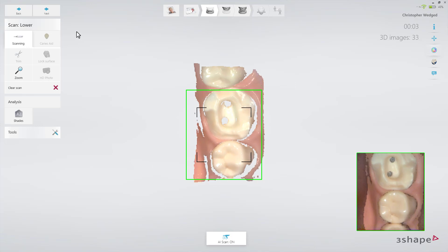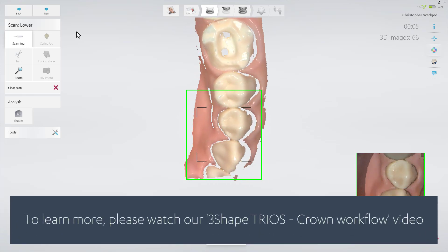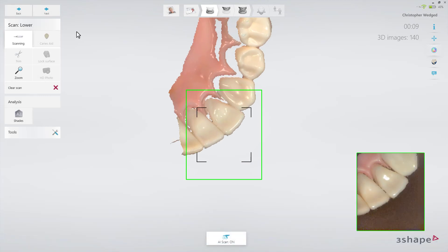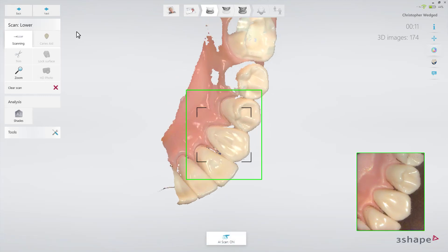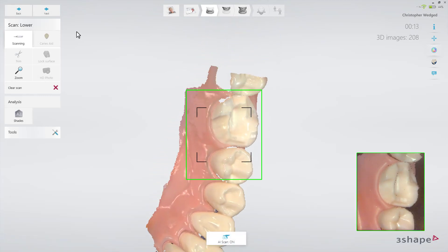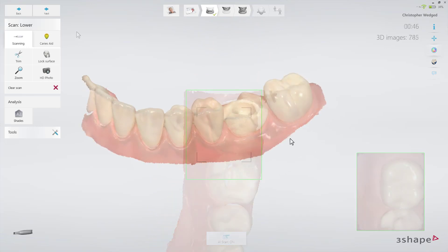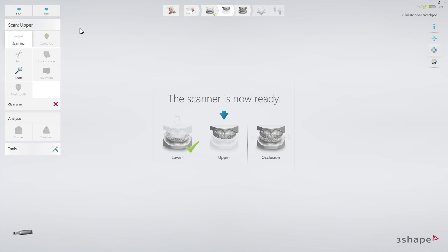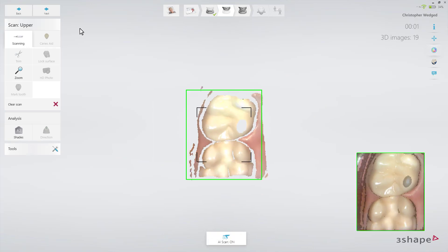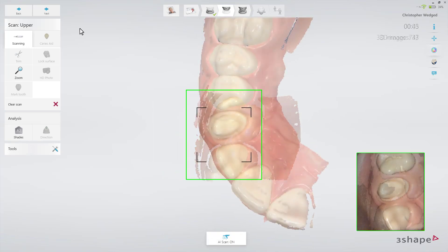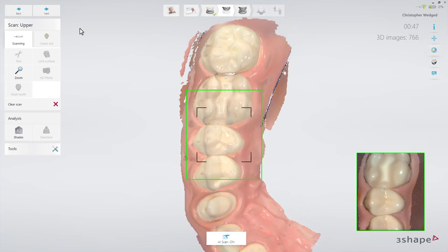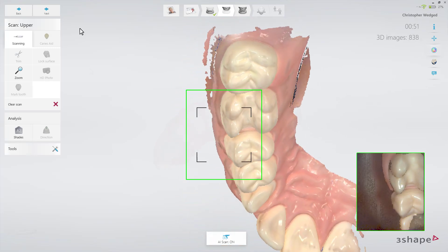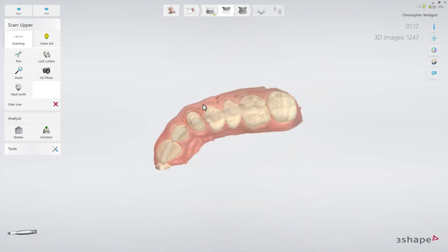For cases where parts of the margin are subgingival, follow one of the two scanning options outlined in the crown video. In this particular case, there are no parts of the margin below gingiva, so simply follow the official scan strategy. Now proceed to the upper arch and scan the same area as in the lower arch, following the official scan strategy.